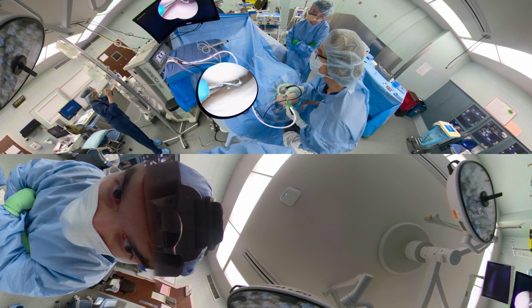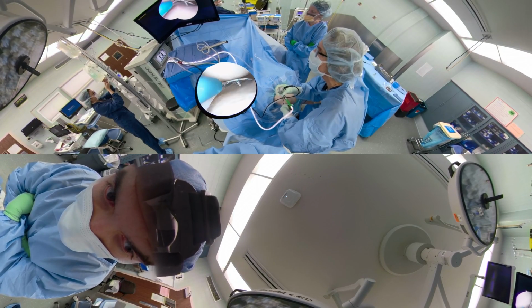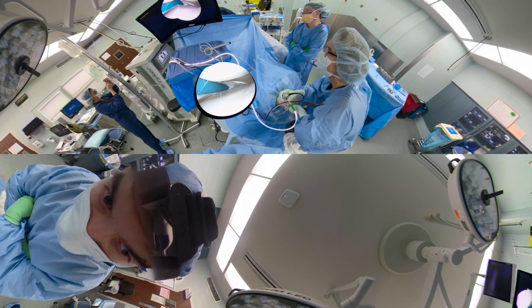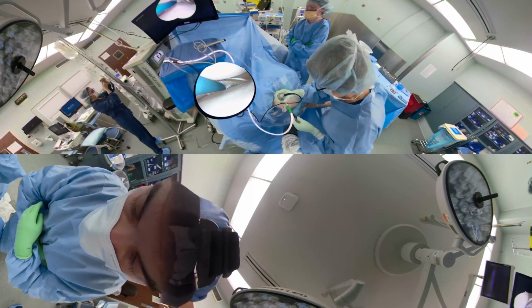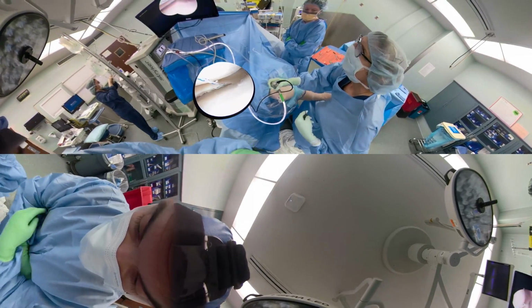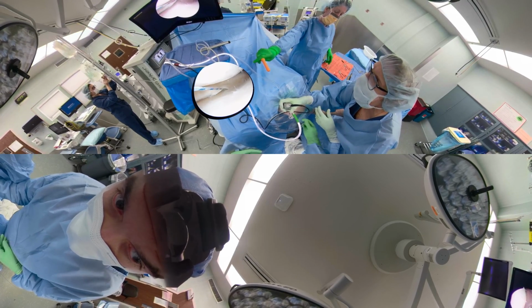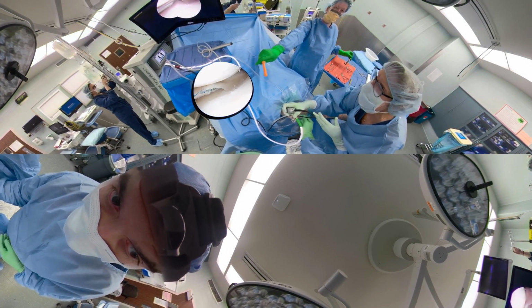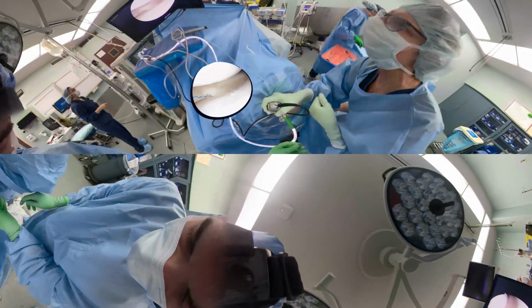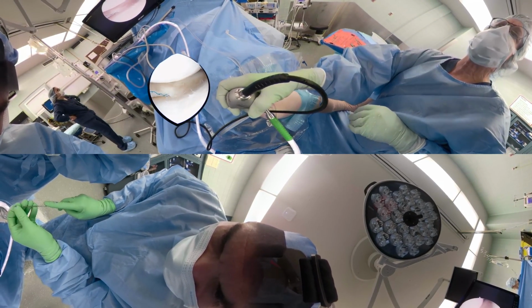So we keep our hand down on the shaft because the shaft can bend. And then we will deploy the pledget manually. And then you can do a horizontal or a vertical. So you don't want to grab the handle. And here's a horizontal stitch into the tibial side. Mechanically, vertical reestablishes the hoop stresses, but sometimes based on the tear pattern, you need to do a horizontal. And that was a horizontal on the tibial side.